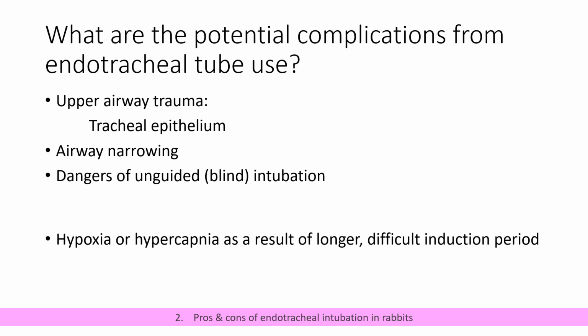And when you're intubating, however good you are at passing an endotracheal tube in a rabbit and whatever technique you're using, it still takes longer than placing a v-gel. So hypoxia and hypercapnia are quite significant complications of the longer induction period that happens when you're intubating your patient. And then you're getting a reduced quality of recovery because, particularly if you're using a blind technique, you're creating more upper airway trauma or potential upper airway trauma that can cause discomfort or pain in the recovery period. And like any mammal, the more pain they're in, the less well they're going to recover, the longer it's going to take for them to start to eat again.